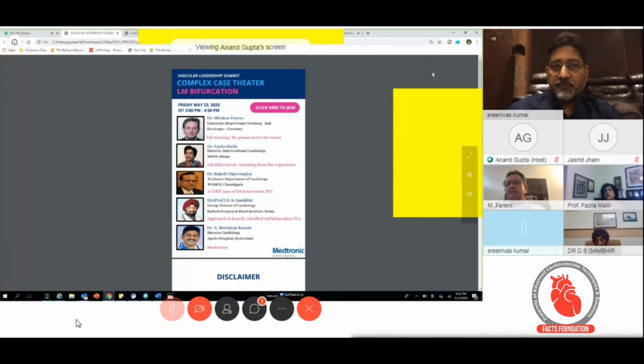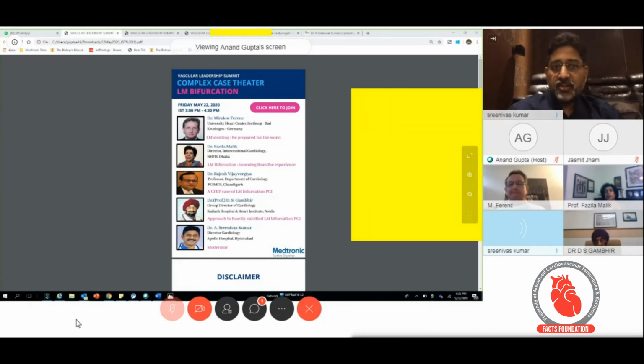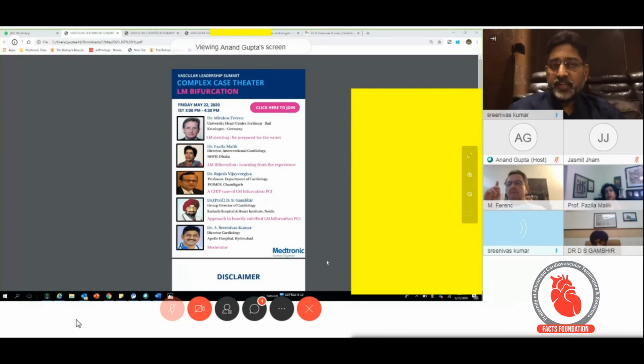And a lot of interesting questions. I hope you have about 10-15 minutes time. Yes. A lot of interesting questions came across on the technique of the left main. I request the speakers to give your valuable opinions on these important aspects of the questions which are being sent. Number one, if the left main ostium is not involved and the disease is there only in the mid to bifurcation, there are some schools of thought which say that the entire left main needs to be covered. Others feel only the mid part needs to be covered. What are your thoughts on it, and how do you decide? I think you can respond, and later Gambhir and others can take it.